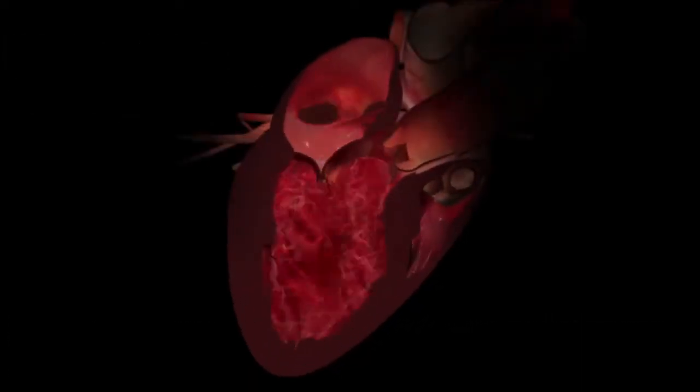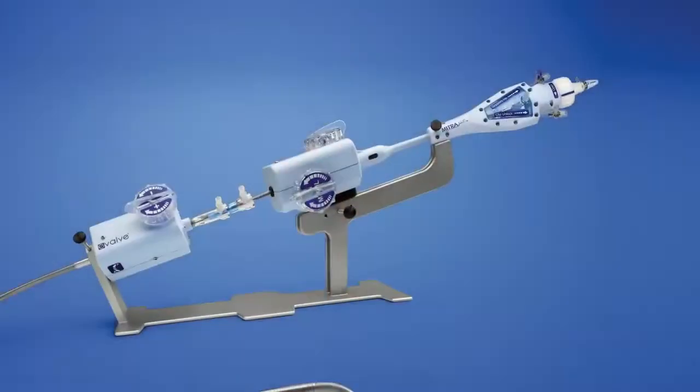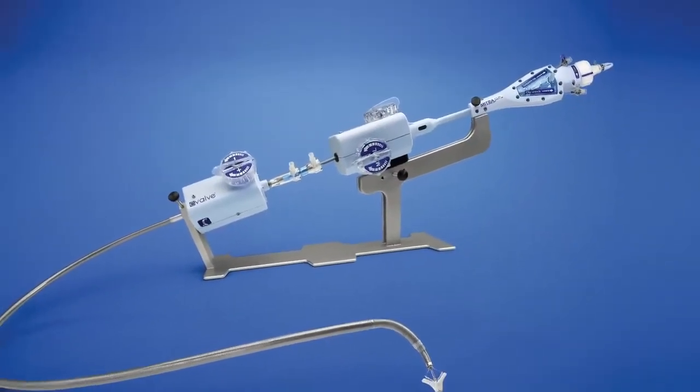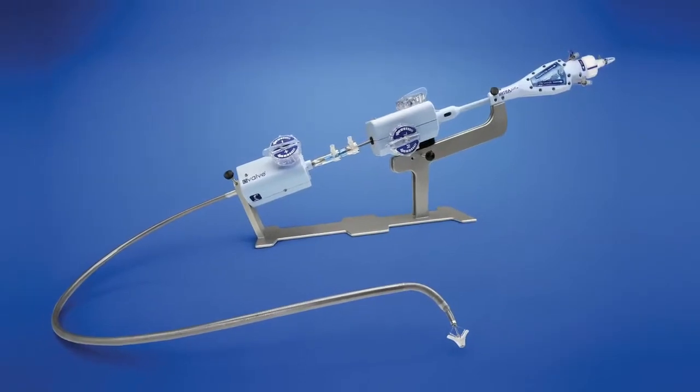The blue flow filling the left atrium illustrates severe mitral regurgitation or MR. The percutaneous mitral repair system consists of catheters and the MitraClip device.